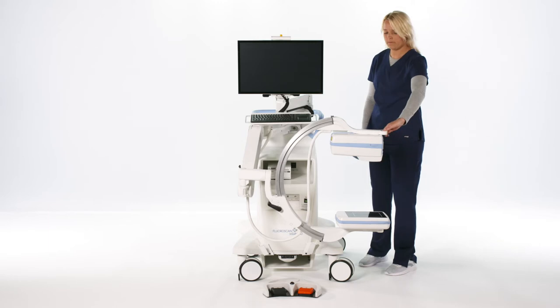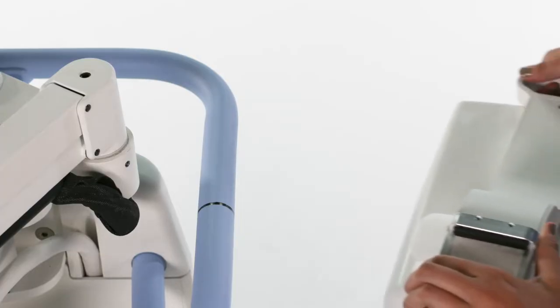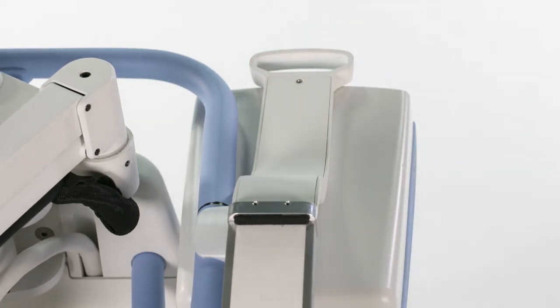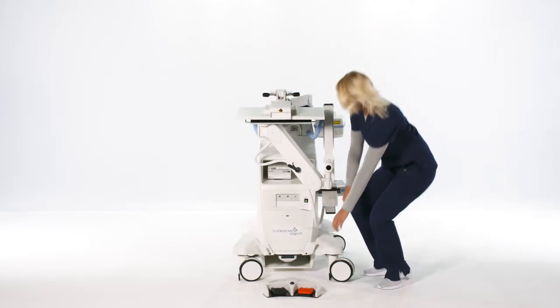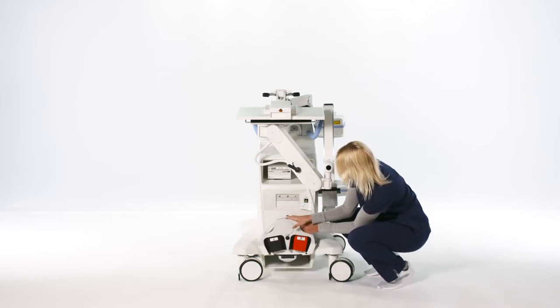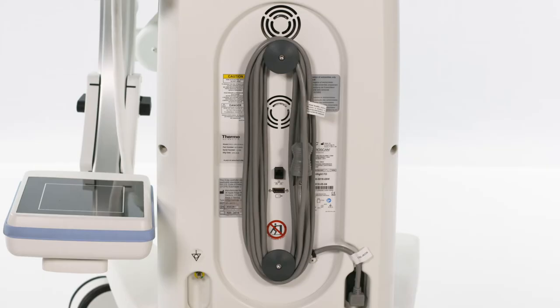To store the C-Arm, clamp the C-Arm to the blue rail. Align the white clamp to be in front of the black line on the railing to keep the machine compact. Flip the monitor forward and down. The foot switch can be stored in the bracket at the front of the system. The power cord can be unplugged and wrapped around the cord guides on the back of the cabinet.